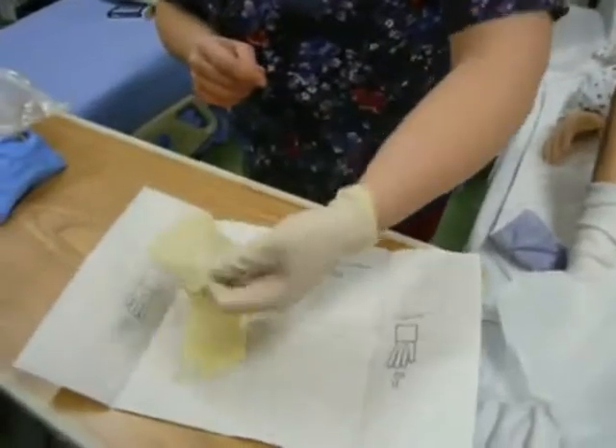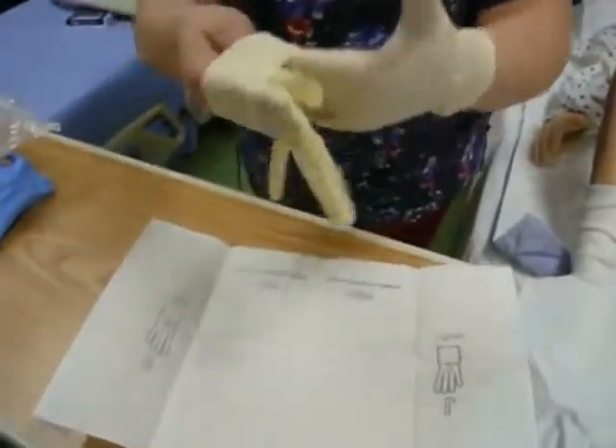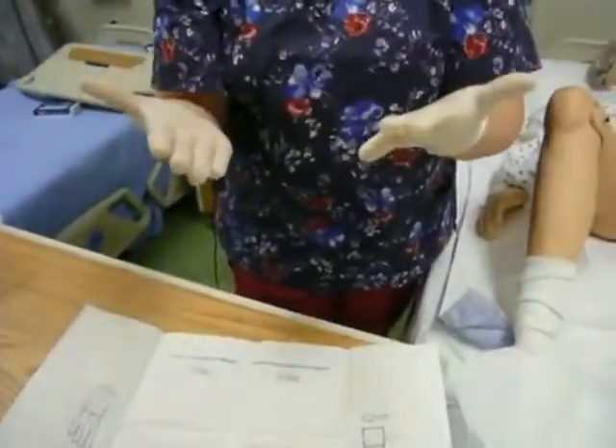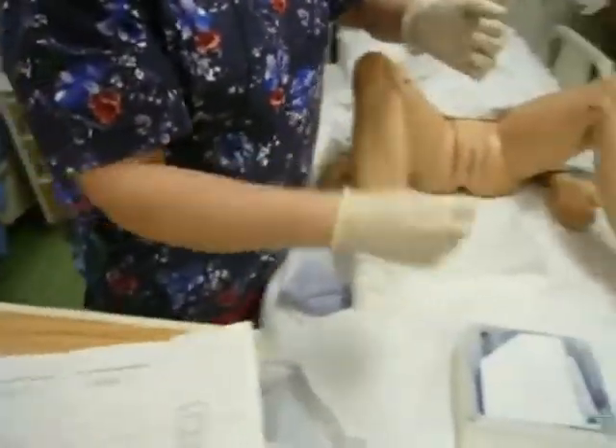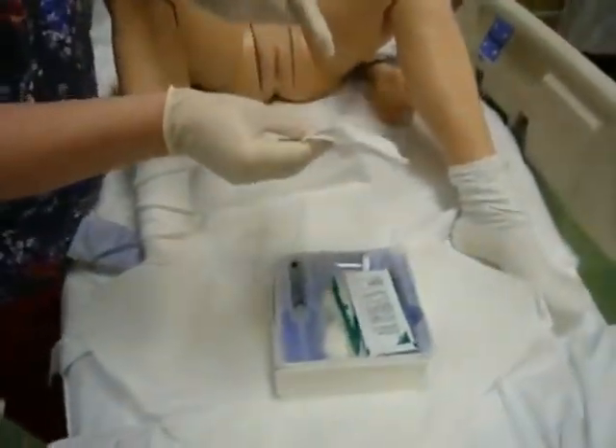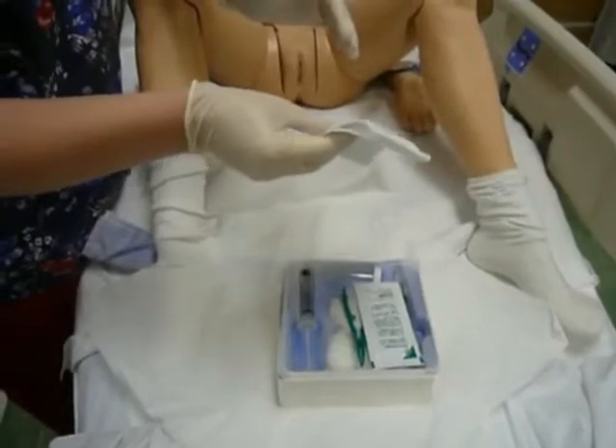The second glove I grab by the cuff, make sure my thumb is out, come up and away, and I'm ready to move back towards my sterile field. This is the fenestrated drape that has a hole in the middle — we don't use that for female cath. My garbage is set up on my bedside table, so you'll see me move supplies off the video screen to put on my garbage pile.